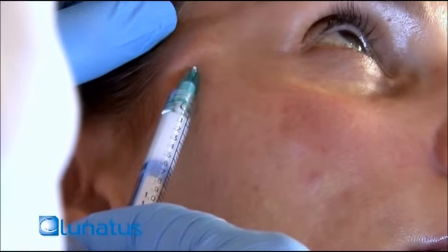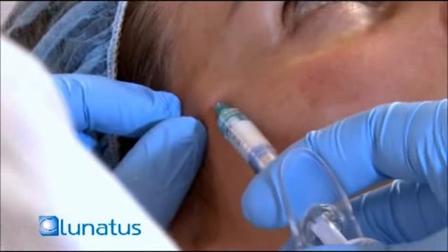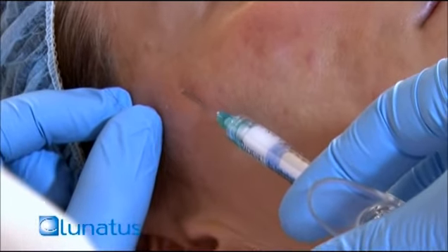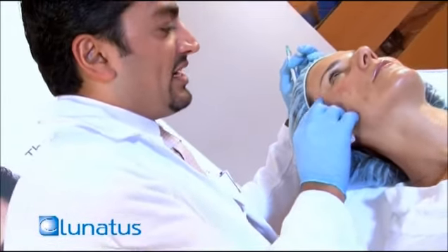Kind of just push into the material. Any pain, Roberta? No, it's a little. Okay. I put a very small amount, kind of come out. You can see that little bolus right over here and I'm going to massage it.